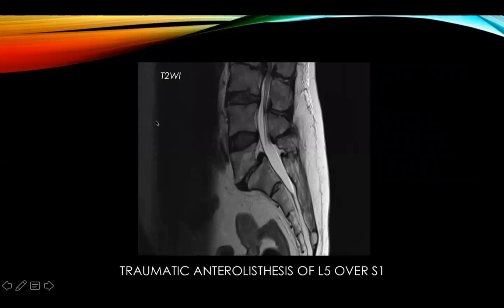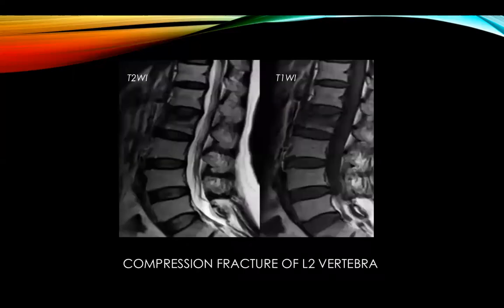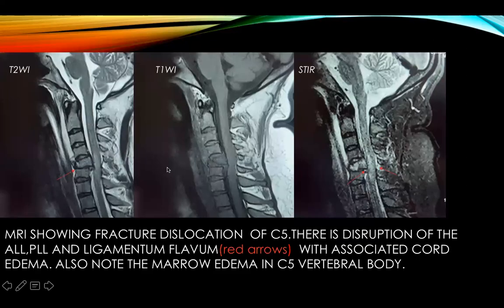The first case shows traumatic anterolisthesis of L5 over S1. In the second case, there is a compression fracture of the L2 vertebra with a dark sclerotic band, commonly seen in compression fractures, along with central wedging.